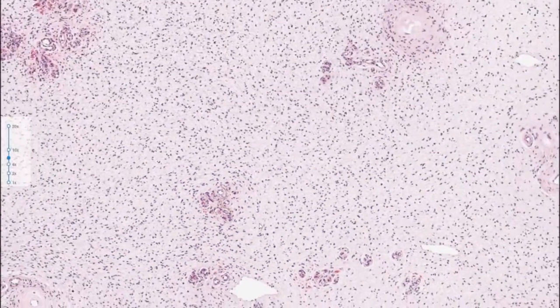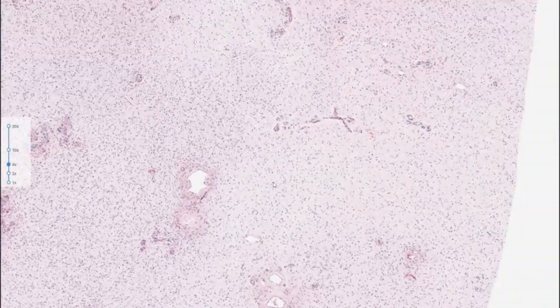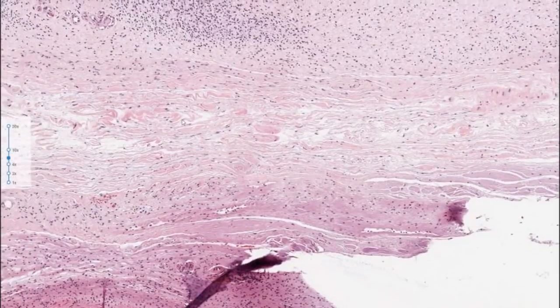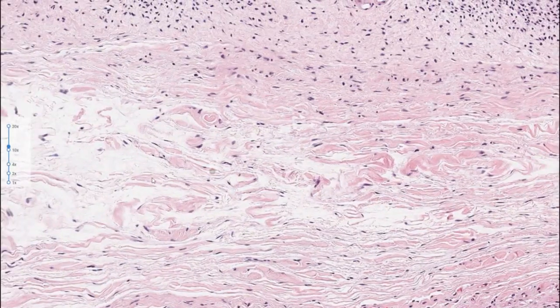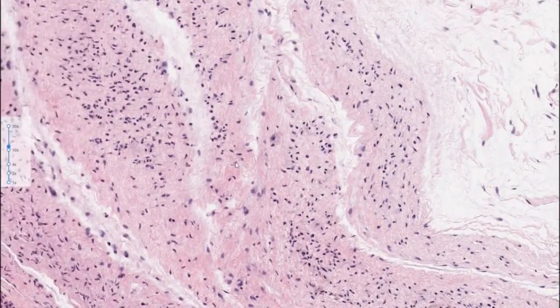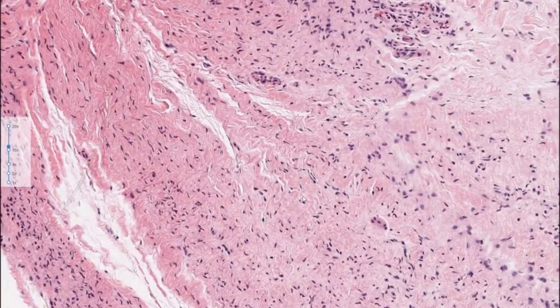Curious finding here. Some vessels. Smaller vessels here. Some cautery, probably. A bit here more of these shredded type collagen, not the best example, but starting to suggest at least some sort of relation to a neurofibroma. Keep moving around. You do here have again a little bit more something that reminds you of neurofibroma.